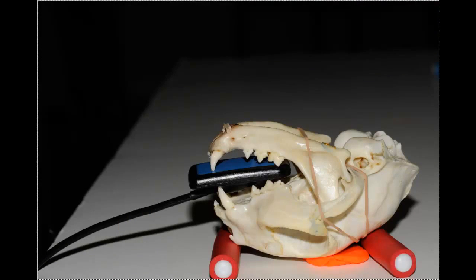Now I have the cat in dorsal recumbency. As you can see, I have a little Play-Doh down here to help hold the skull in place. Obviously, we're not using this on a real animal, but just for purposes of allowing me to demonstrate this. And again, I have the sensor in place, pretty much like a sandwich. And the angle of that sensor is about like so.